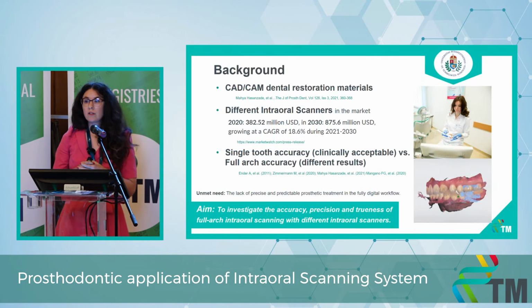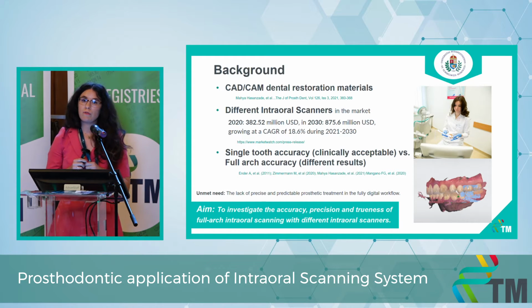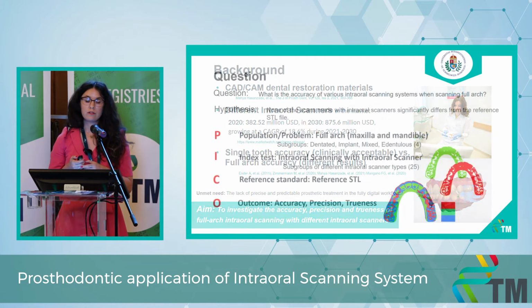Some of the dental materials can only be manufactured with CAD/CAM technology, which is computer-aided design, computer-aided manufacturing. And to use this kind of technology, we always need a three-dimensional file, which is usually an STL file. Intraoral scanners are the devices which can make this kind of 3D files. We can find many of them in the market, and they are said to be accurate enough for single tooth restorations, but the full arch accuracy is questionable. Therefore, our aim was to investigate the accuracy of the different intraoral scanners, so their full arch scans.